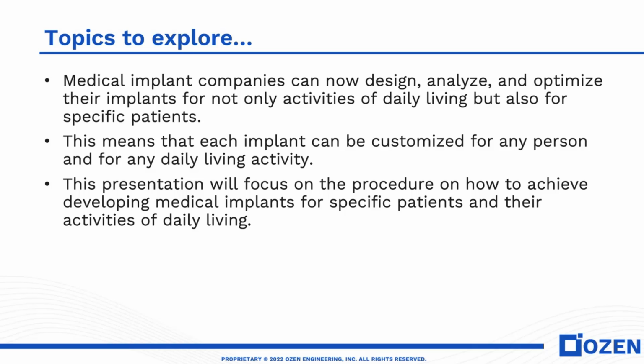And in this webinar, we are going to explore the following topics. Basically, we'll start with the medical implant companies that can now design, analyze, and optimize their implants, not only for activities of daily living, but also for specific patients, meaning patient-specific data can be used.